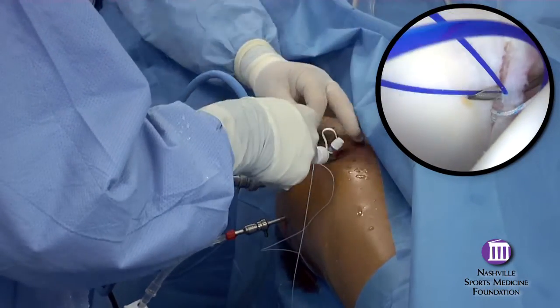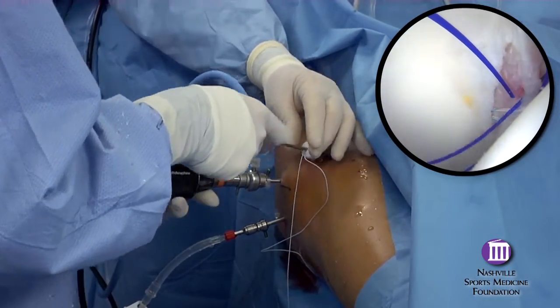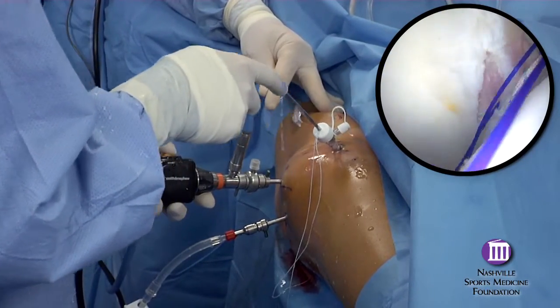One technique is using a monofilament suture as a shuttle for passage of the braided anchor suture.